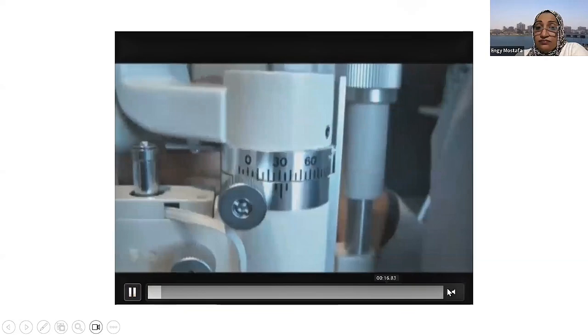So we are all familiar with retinal drawings, where you can express your findings with drawings. Actually, this is also possible with corneal pathology. You can express the findings in color coding, like black, blue, red, brown, green and yellow. You can show a stained area, an ulcer, superficial and deep vessels, and of course if there are pigments, edema, hemorrhage or keratic precipitates, these can all be in your ophthalmological examination sheet.